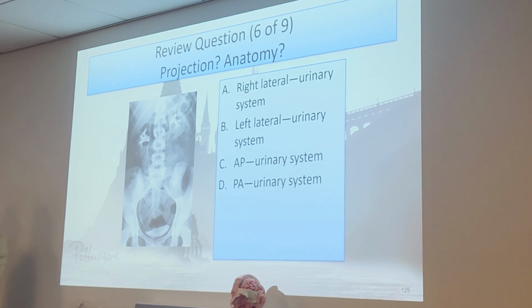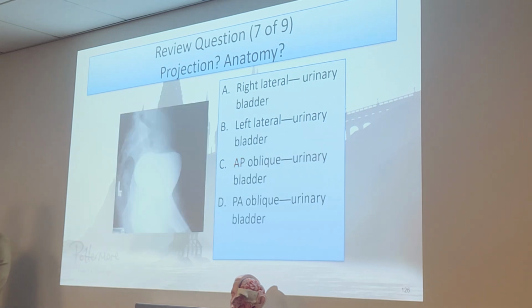What is that one? Boy, this is a really good question here. That's a pretty image. That's a great one for labeling for hot spots. See? That's just an AP urinary. Why? Because we don't do PAs, and it's obviously not lateral. That's common sense, so it has to be AP. Great labeling image here, guys. I'm gonna say it again, great labeling image for a hot spot exam, if I do say so myself. Good to know.